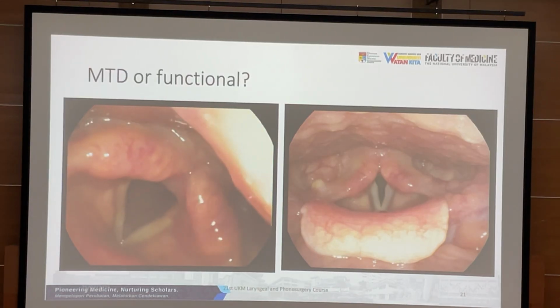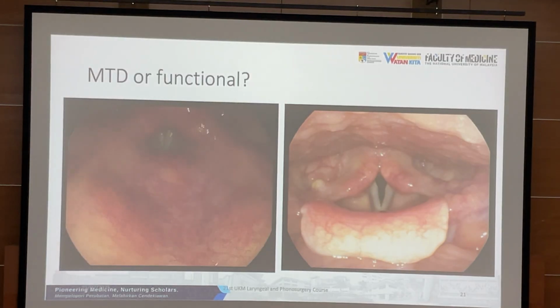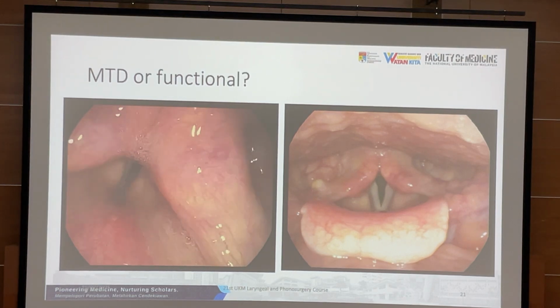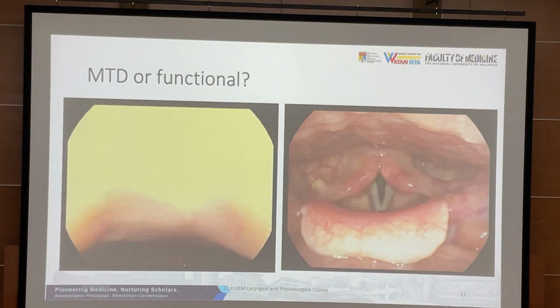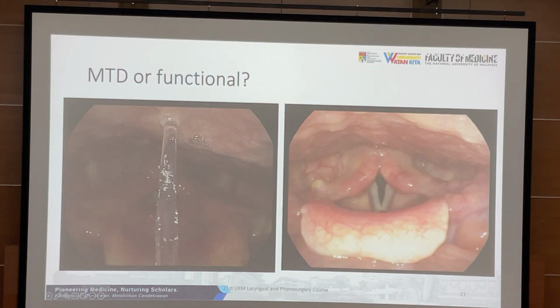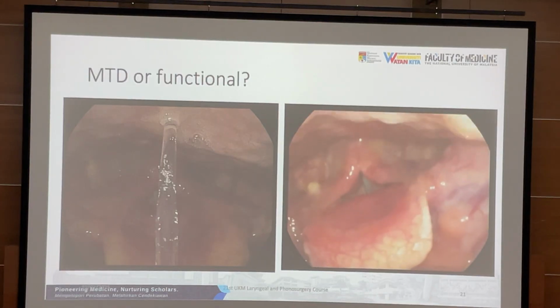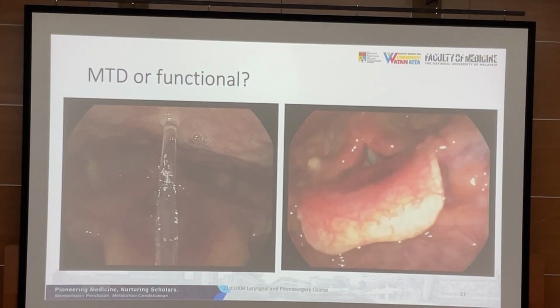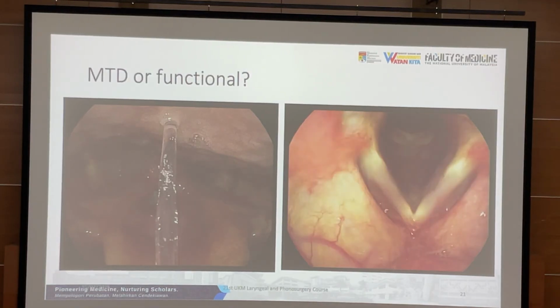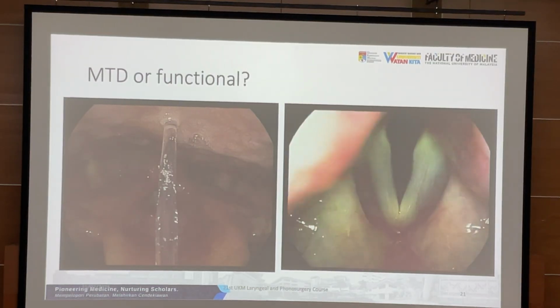This is not yet stroboscopy. This is stroboscopy. I think that is enough. And the second video. There's nothing wrong with the vocal fold. Everything is perfect. The patient is talking like this.